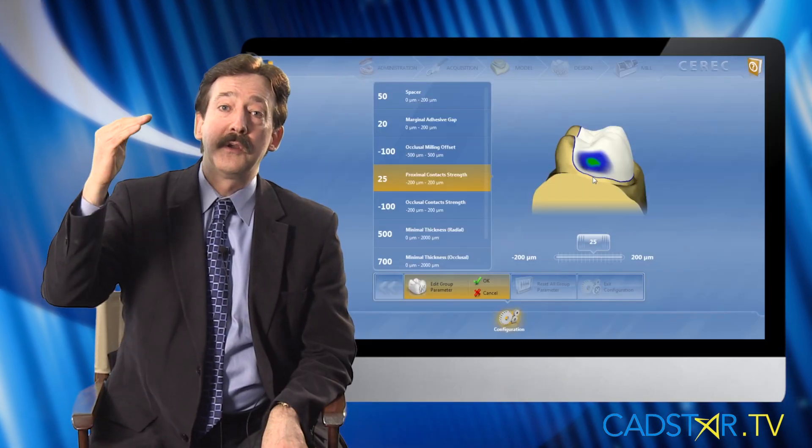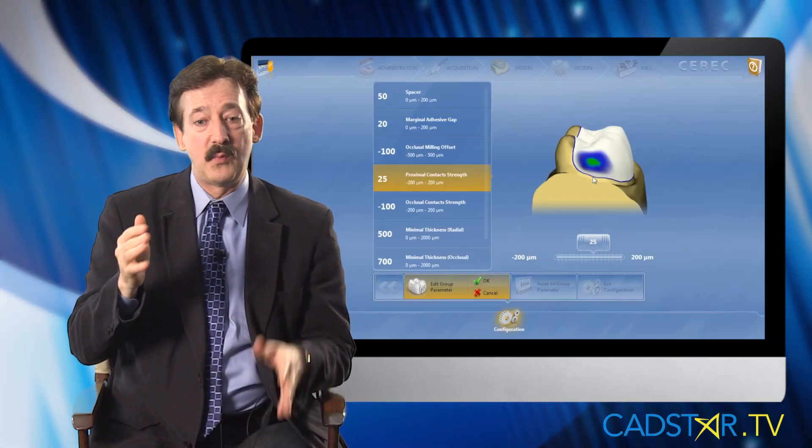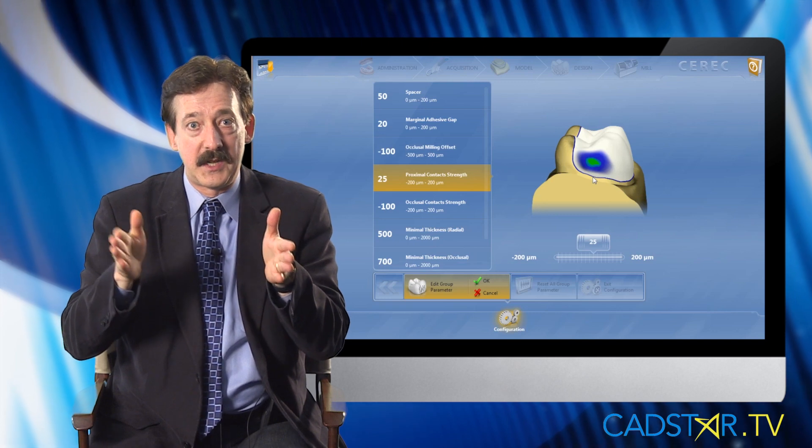As we go more toward the posterior component of the mouth, the proximal contact diameter becomes larger. Think of the distal of the upper first molar — that's a large contact. An average amount may be four millimeters across and five millimeters high. Unless we optimize that surface next to the virtual design, we're not going to get those ideal interproximal contacts.